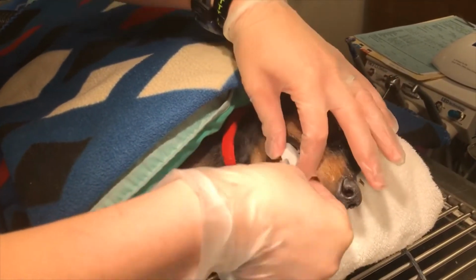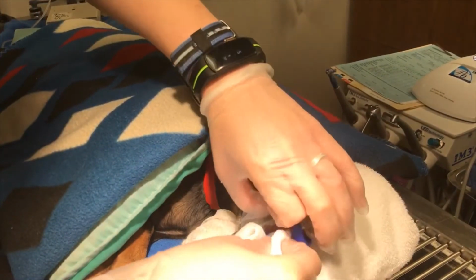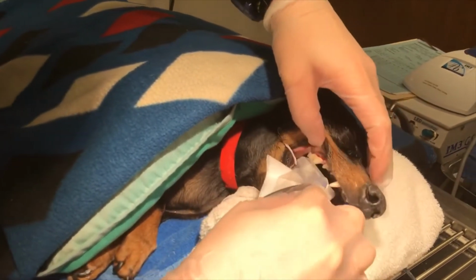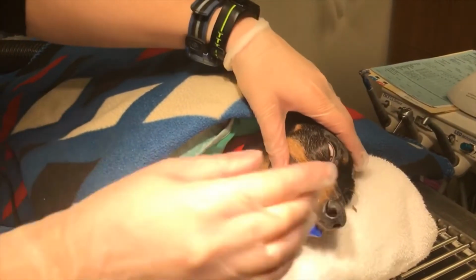I'm going to place it firmly in there. You can use gauze to help support the back of the plate. There we go. Once it's firmly in place there.